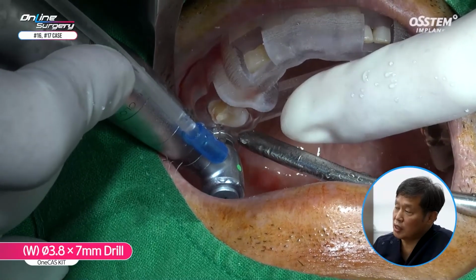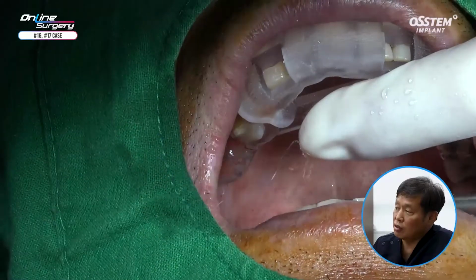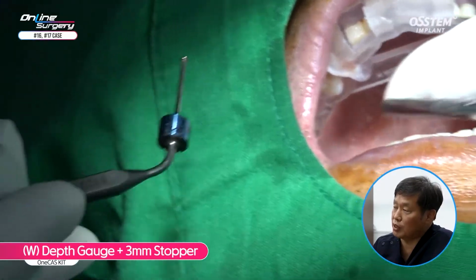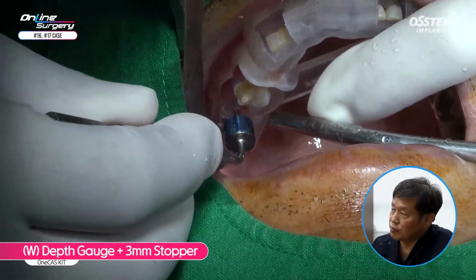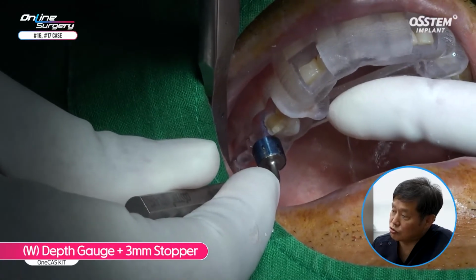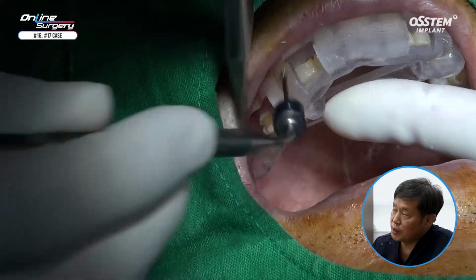In the case of OneCAS, the drill hole is expanded, and you need to progress while using the final drill. It has been drilled up to 7 millimeters, so a 3 millimeter stopper is used on the depth gauge. You can see there's contact. Sinus floor is penetrated.